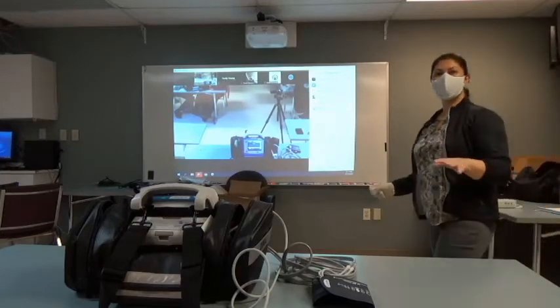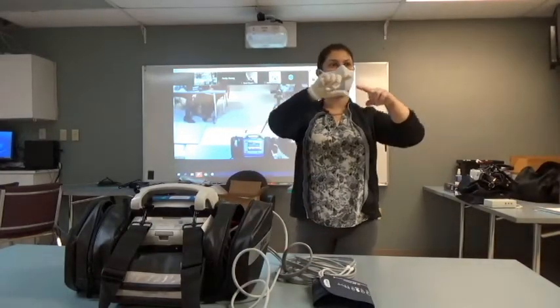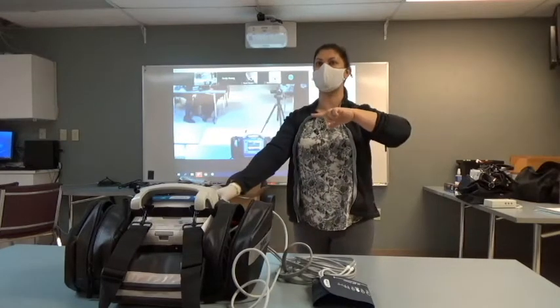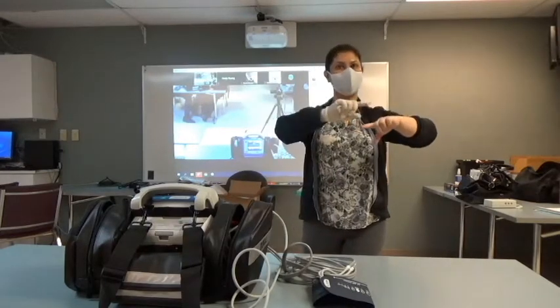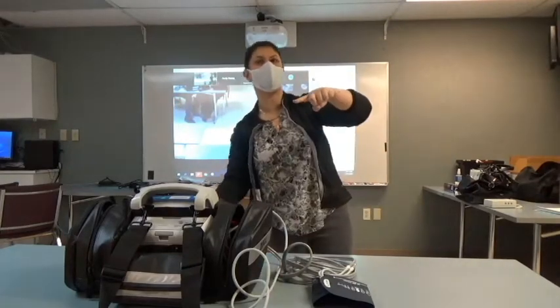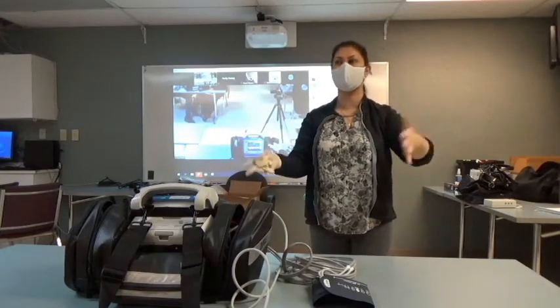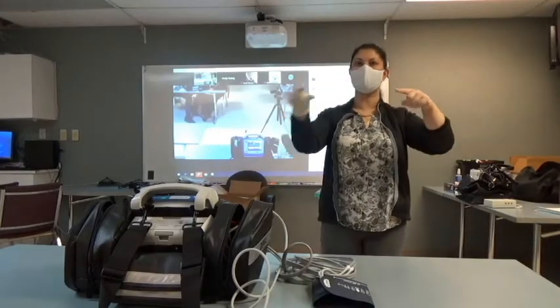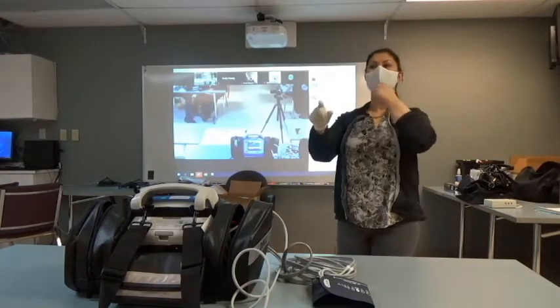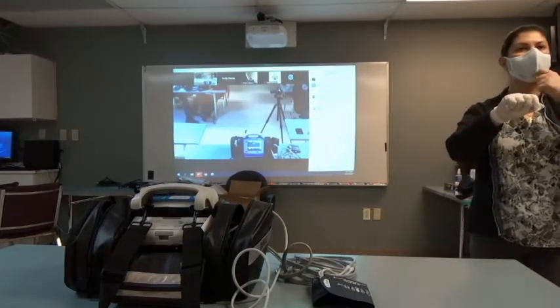If you're getting a message that says check sensor, it's maybe because somebody put the pulse ox on and then set it down on the table. That's an event. If you put it back on again and then take it off again, it's a new event. So if you're wondering why this isn't stopping when I hit the alarm button, that's why. Every time we do this, it'll create a new event. But that's okay. Why don't you guys put the pulse ox on so you can see what I'm talking about?